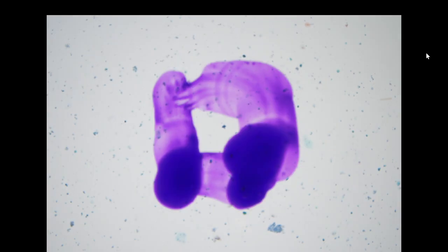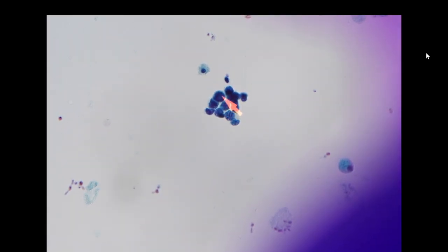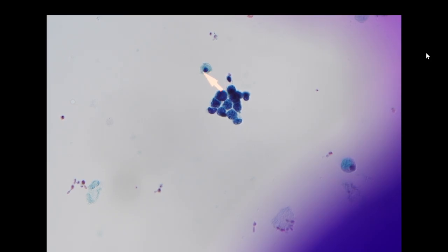And here is relatively indistinct, but on low power you can appreciate it is very hyperchromatic. So we have one cluster of very hyperchromatic cells, and when we go to higher power, the cells have a very high N/C ratio, and the size of the nucleus is actually increased. This is a relatively benign looking, probably histiocyte. So here we have an Indian file and molding pattern. The chromatin pattern also appears to be salt and pepper. So this is a small cell carcinoma.